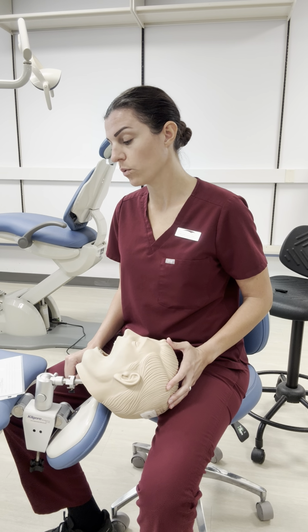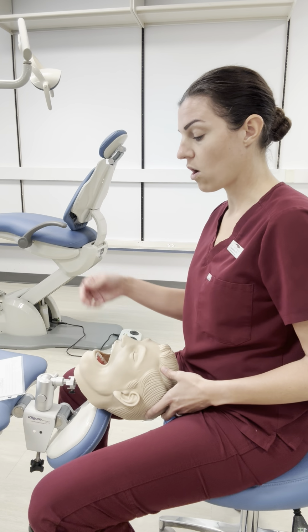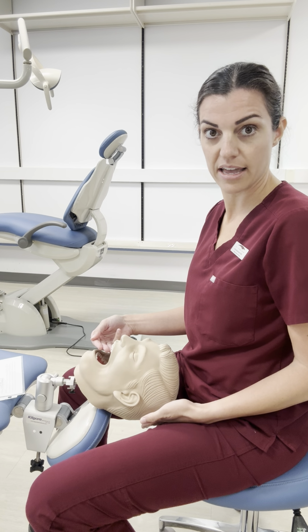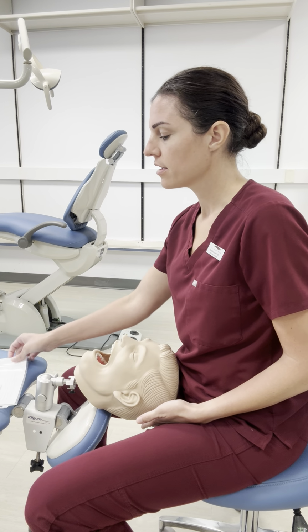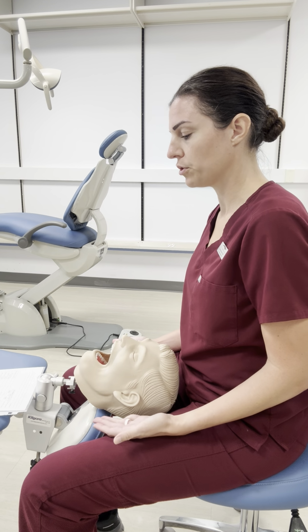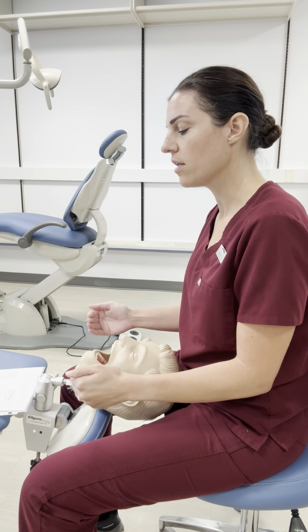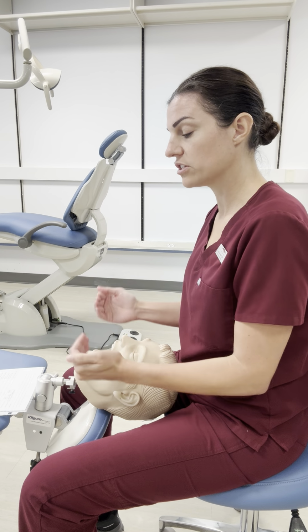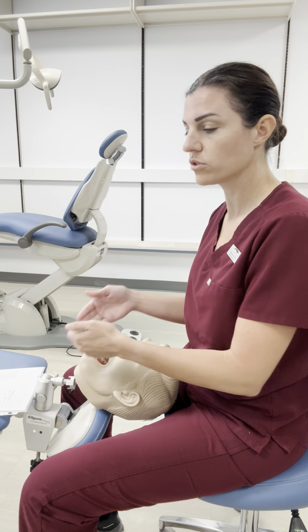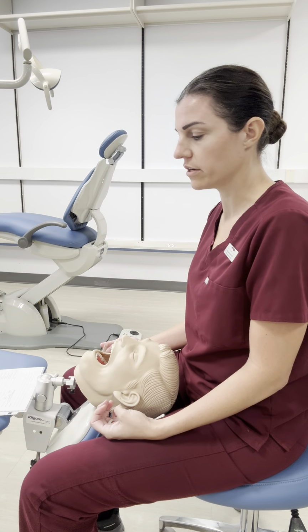Maxillary anterior lingual surfaces away. So we're back up to the maxillary anterior. On that lingual side, so we'll be using that indirect vision, right? Okay. We'll be at 12 o'clock. Patient has their chin up and neutral. Okay, we'll be in the same position for the maxillary anterior lingual and for the surfaces away and towards. So away and towards will be in this position here. Okay, and that's for those lingual surfaces.